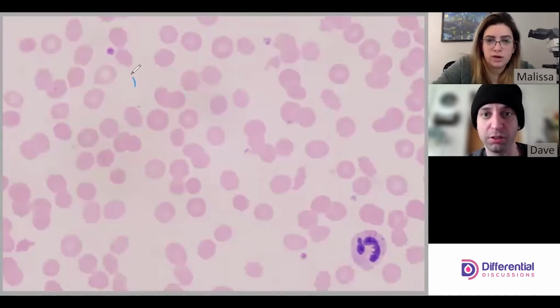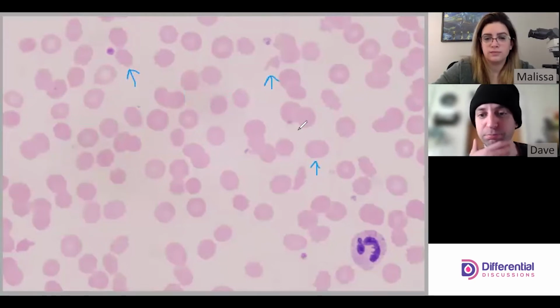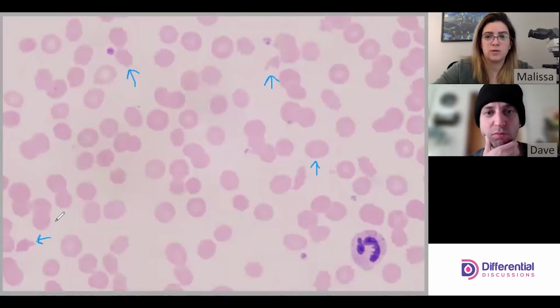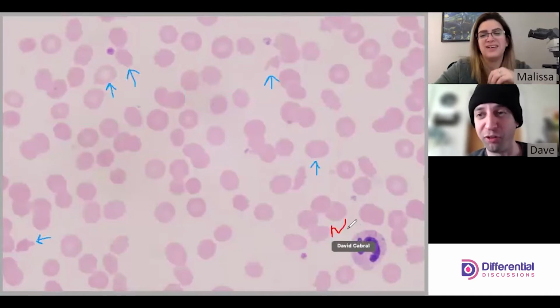Yep. So you've got echinocytes. You've got some ovalocytes. So this guy's kind of an ovalocyte on his own, excuse me. And then yes, there's a schistocyte. I think it's mostly echinocytes, some ovalocytes, and then the occasional schistocyte, because there is another one over here. But again, it's something we'll have to keep track of, see if we want to call it. Right. Mental note. And then there's a teardrop here, the obligatory, that's an N for our viewers.